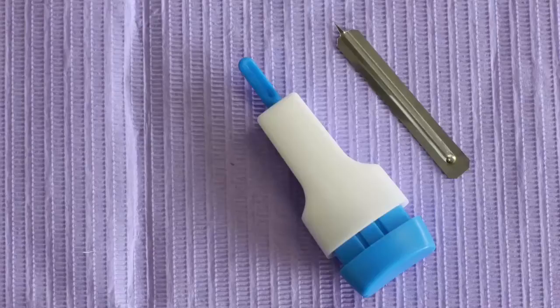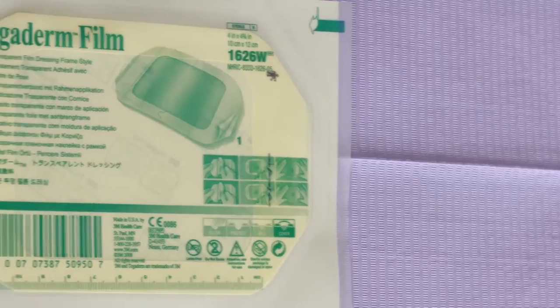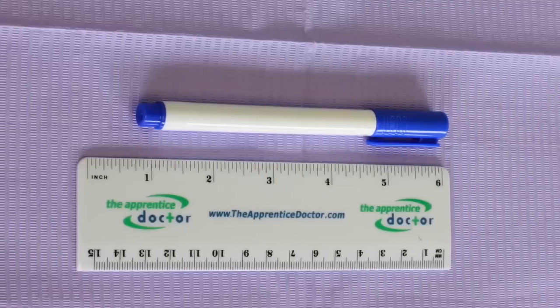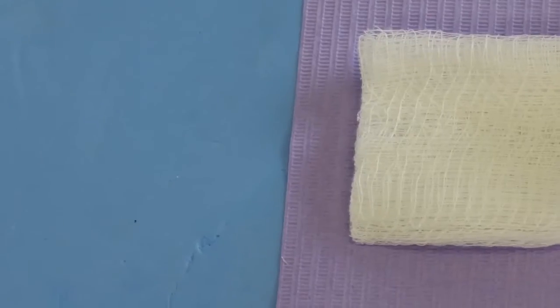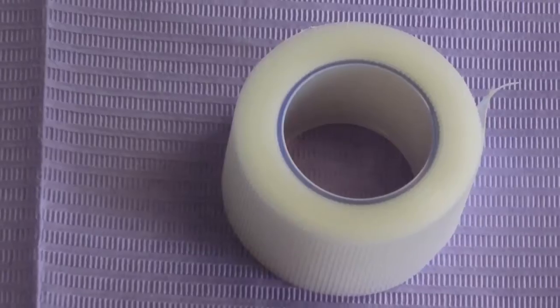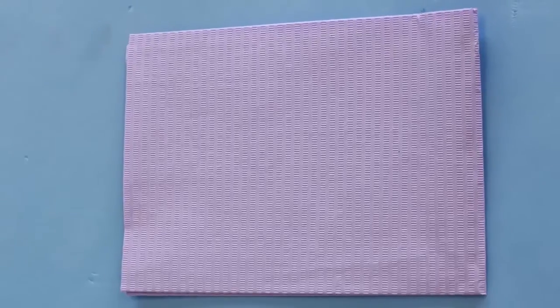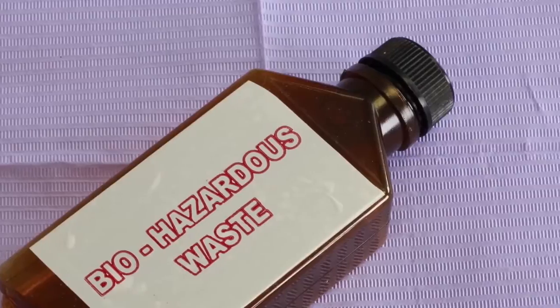Regular and safety lancets, assorted tourniquets, wound dressings, skin marker pen and ruler, alcohol prep swabs, clean gauze squares, cotton swabs, strapping, work surface covers, non-latex gloves, sharps waste container.